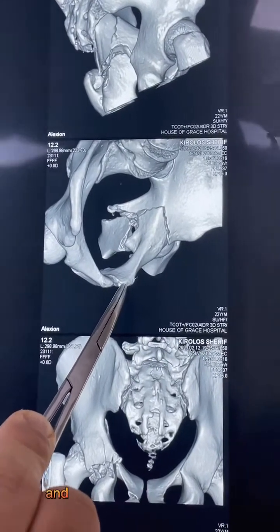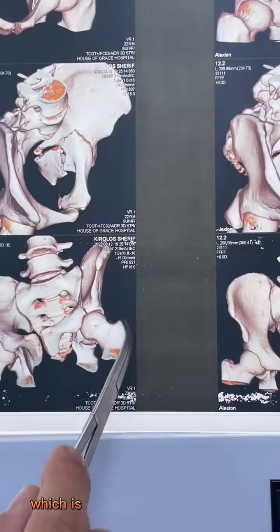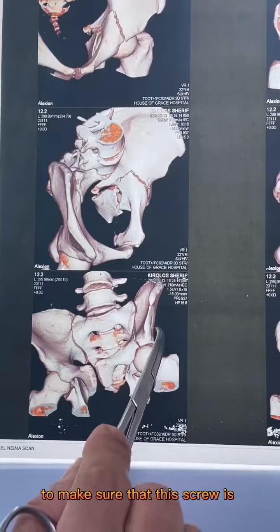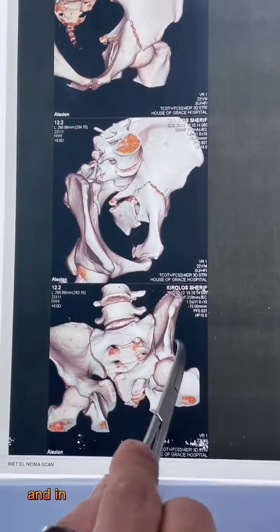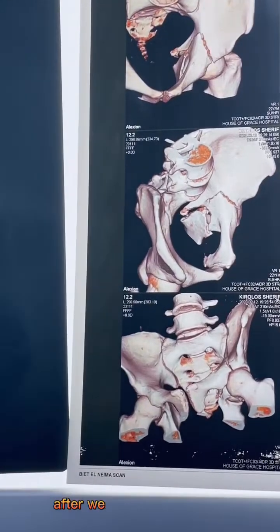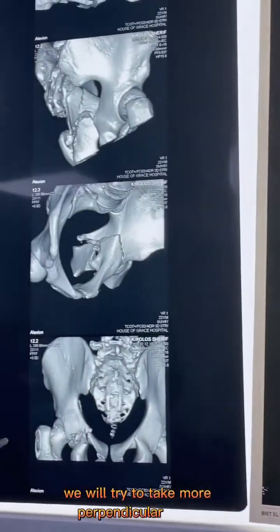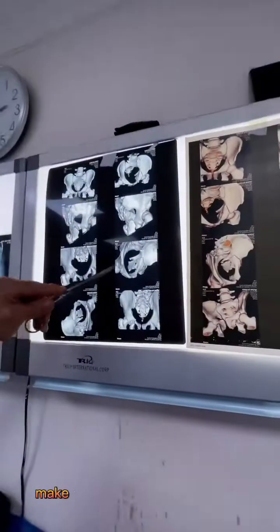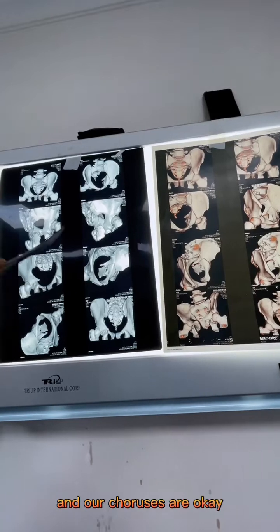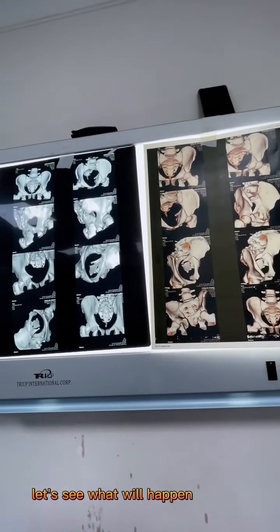And then we will take another perpendicular view, which is the obturator outlet view, to make sure that the screw is extra-articular and in line with the long axis of the anterior column. After we took these two views, we will try to take more perpendicular views. Make sure that our entry point is okay and our corridors are okay, and then we will go with the screw. So let's see what will happen, inshallah.